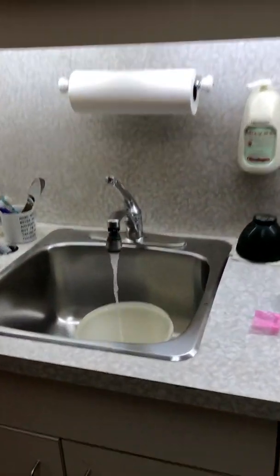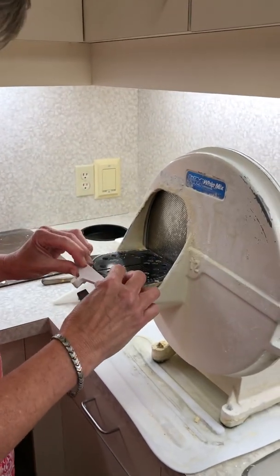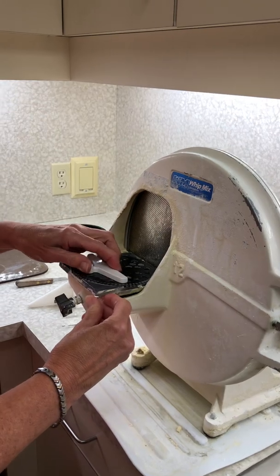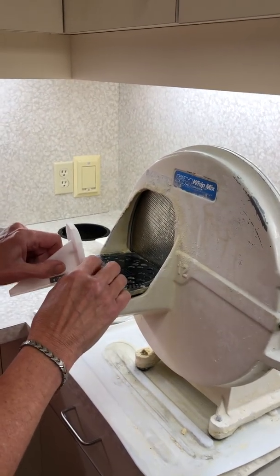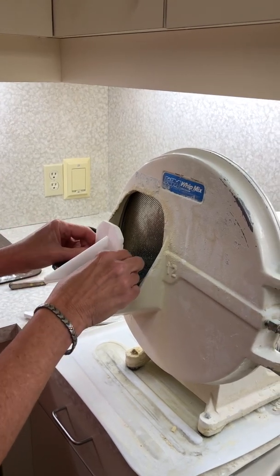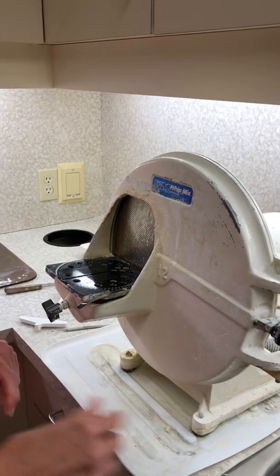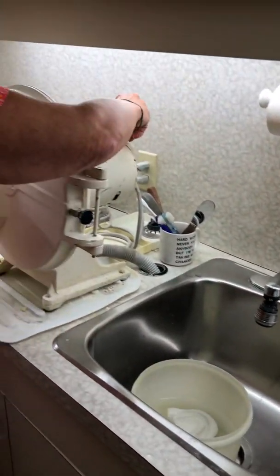Over here we've got our grinder. There's a couple tools. This is your angle decider. You'll go in like this with that. We can adjust our angles. We'll discuss that later on as well. This is going to help us with paralleling and getting our bases leveled off. So that's it. I'm going to shut the water off and we'll turn the grinder on.